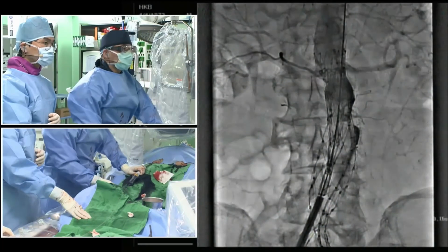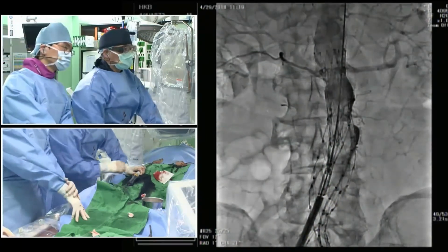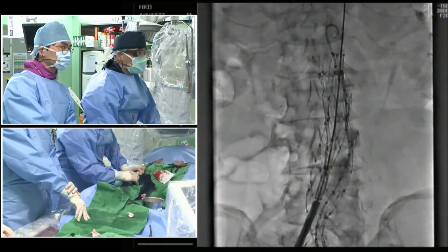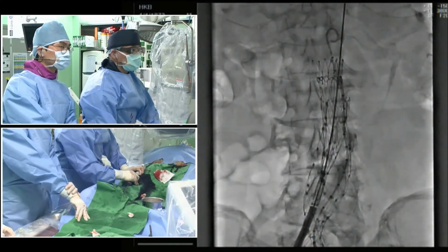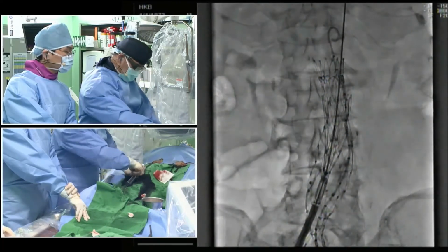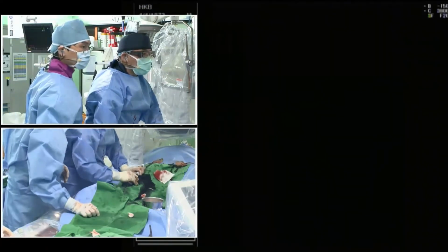Okay. So maybe come down 1 centimeter, a little. Yeah. So I'll bring the whole system a bit downwards. Okay, that's good. Maybe take another shot. Okay, another picture. Here, okay, it went up a little bit.